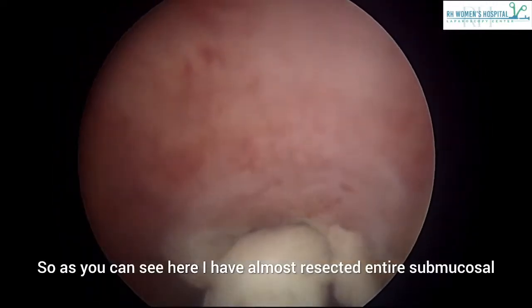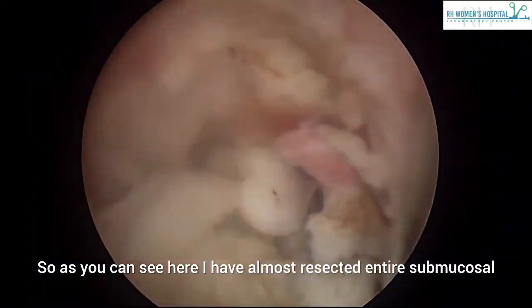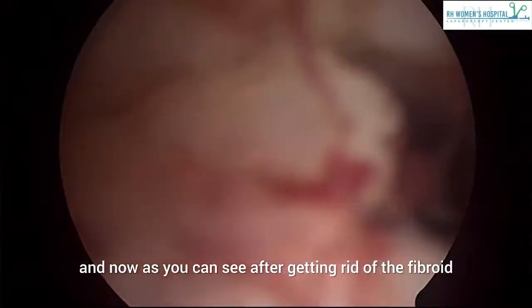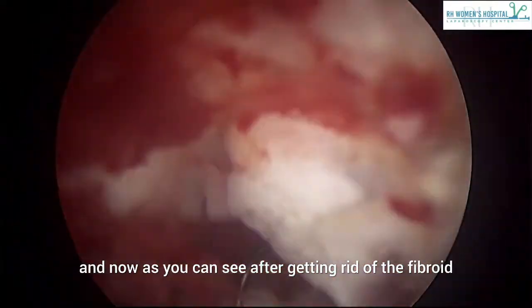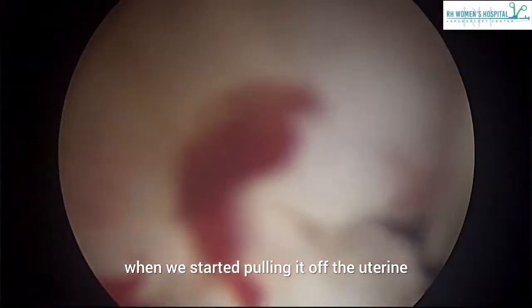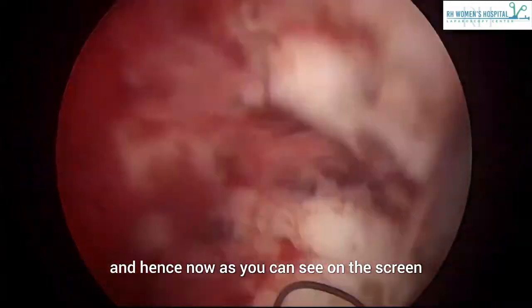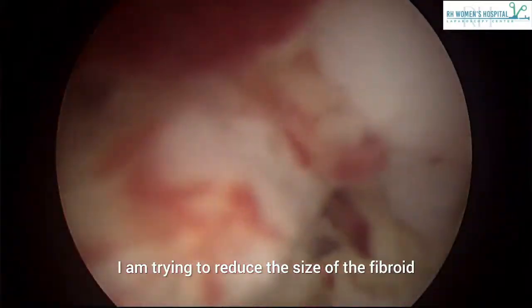So as you can see here, I have almost resected the entire submucosal as well as the intra-myometrial component of the fibroid. And now, as you can see, after getting rid of the fibroid, when we started pulling it off the uterine cavity, it wasn't coming out because of its size, and hence now, as you can see on the screen, I am trying to reduce the size of the fibroid.